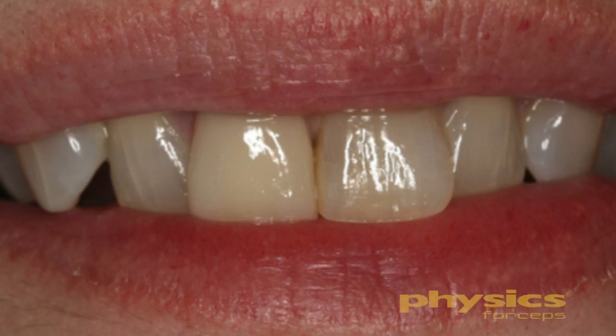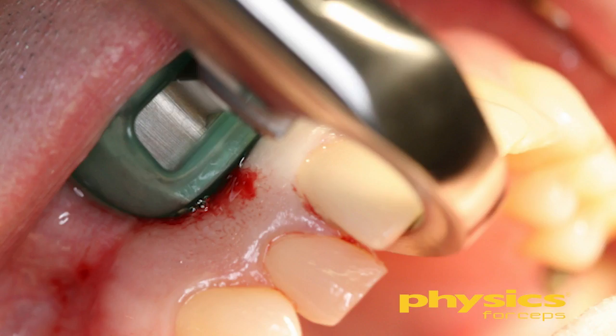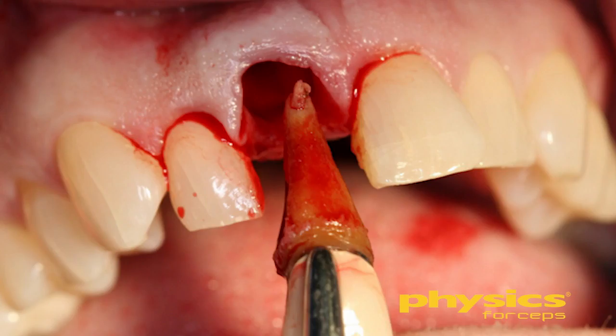More importantly, we have good facial bone, we maintain the interproximal bone, and we will be able to maintain the interdental papilla. This instrument is outstanding also when you have veneers on adjacent teeth. Many of us have tried to luxate a tooth around existing crowns or veneers and easily broken porcelain. You won't do that with this technique because there's no pressure being placed on the adjacent teeth or adjacent porcelain at all.